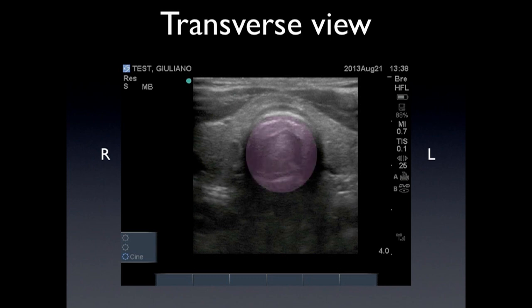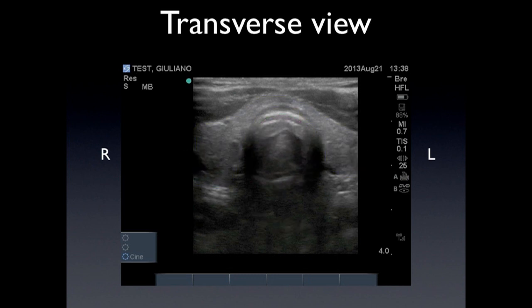This is the transverse view. You're going to see where the trachea is — there in the middle of the screen — and anterior to the trachea you're going to have the thyroid. You're going to have the right lobe and the left lobe connected by the isthmus.